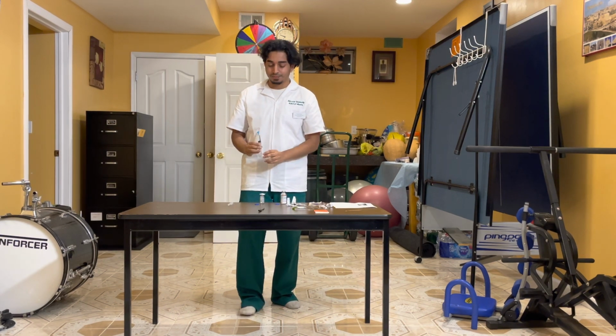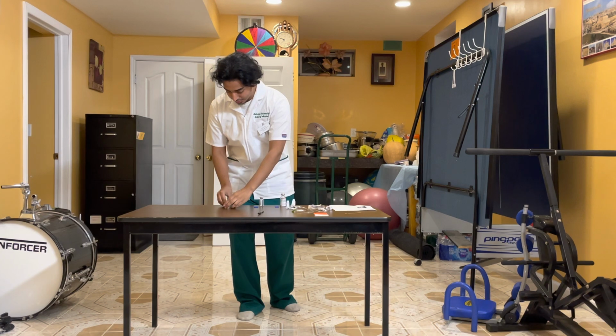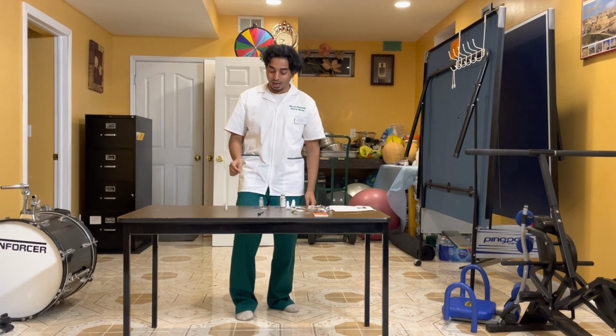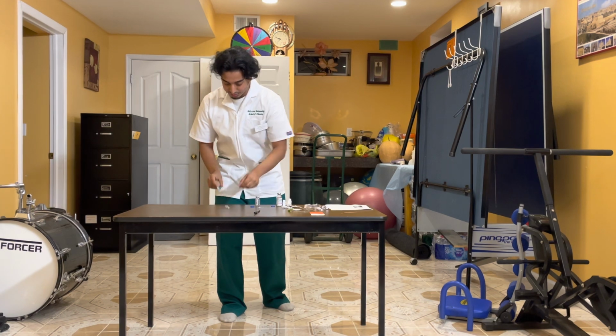Now that I have that, I'm going to put it back in safely into the cap. And I'm going to take out my vancomycin, which is perfectly clean. And I'm going to be inserting the 5.6 milliliters into the vancomycin.